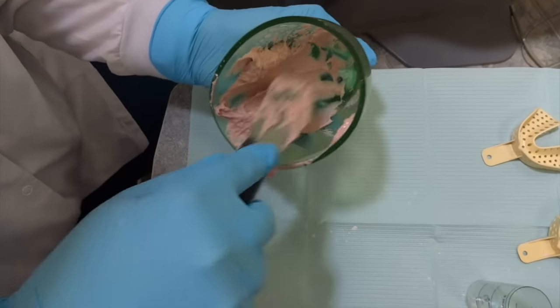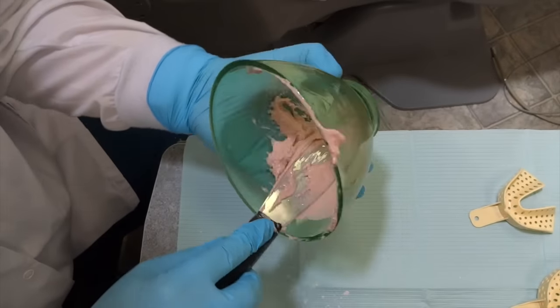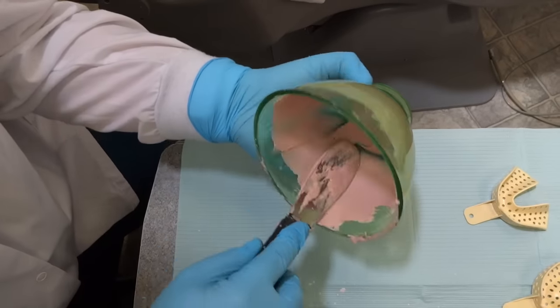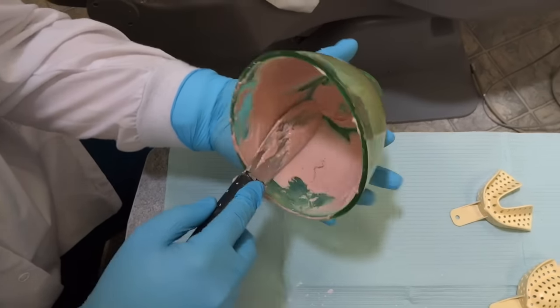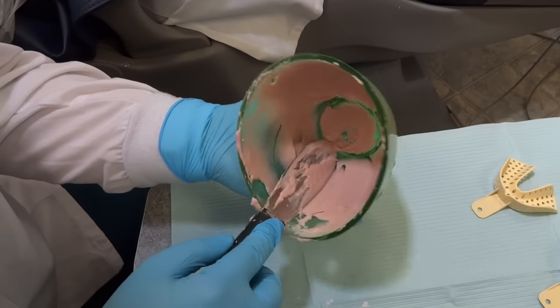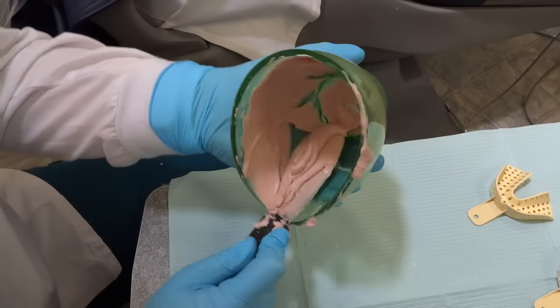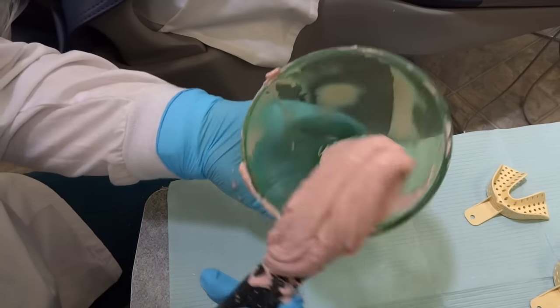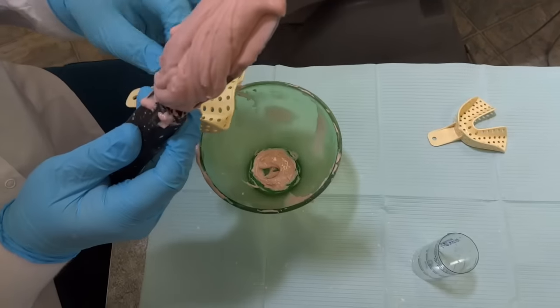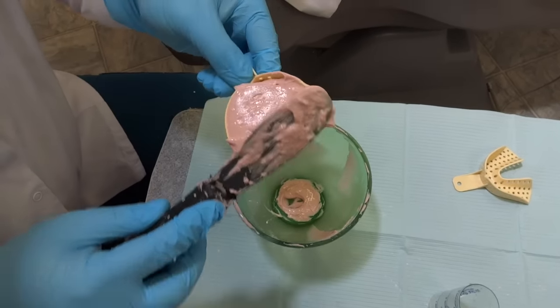Once you notice that all the clumps are out, get a lot on your spatula and go along the sides of your bowl. This really helps get all the bubbles out and makes your impression a lot better. Once you've gone along the whole bowl and all the bubbles are out, just take one scoop with your spatula all the way around and you're ready to load it into your tray — nice and smooth with no bubbles.